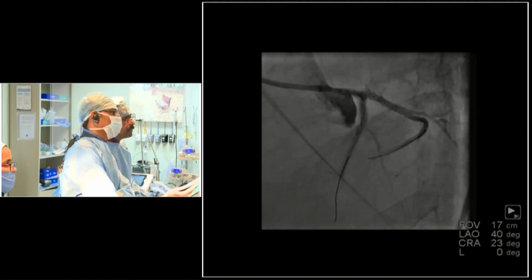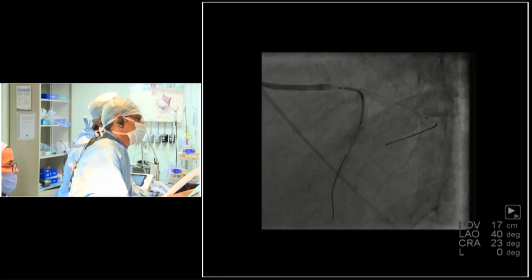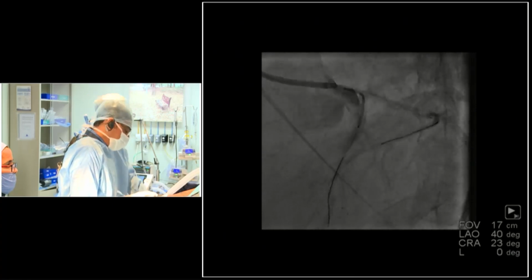The stent looks very long, and we have to come back a little bit more. Are you okay? I think we're okay. Ostium, yeah, it is okay. So what do you think? The position looks okay?